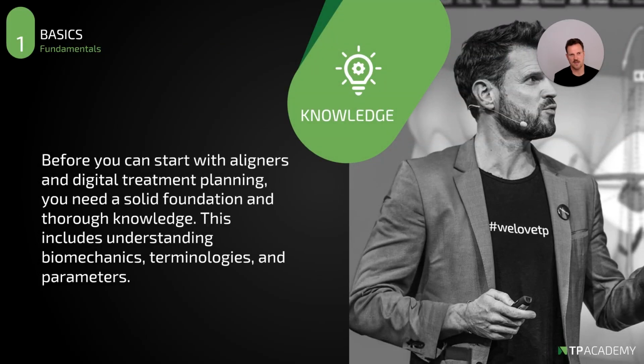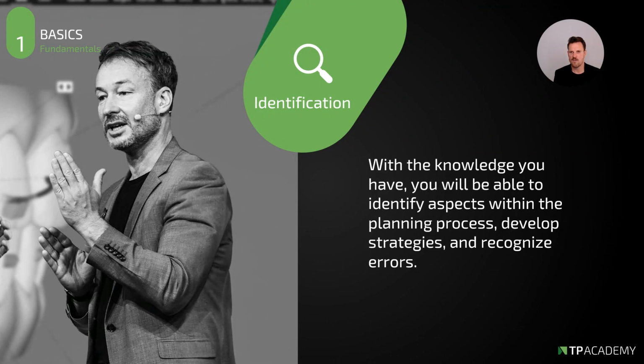Before you can start with aligners and digital treatment planning, you need a solid foundation, and this is your solid knowledge. This includes understanding biomechanics, terminologies, and also the different parameters of the software. With the knowledge you have, you will be able to identify aspects within the planning process, develop strategies, and also, and I think this is most important, recognize errors, recognize software errors, software problems, and so on. And we will go very, very deep in this topic.